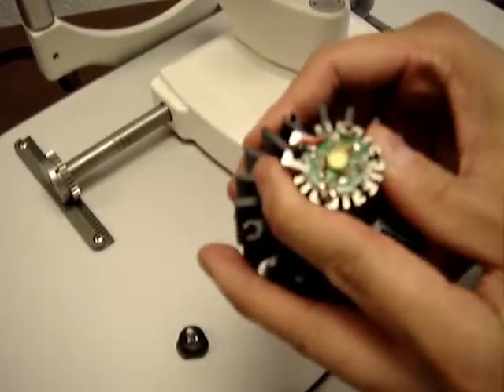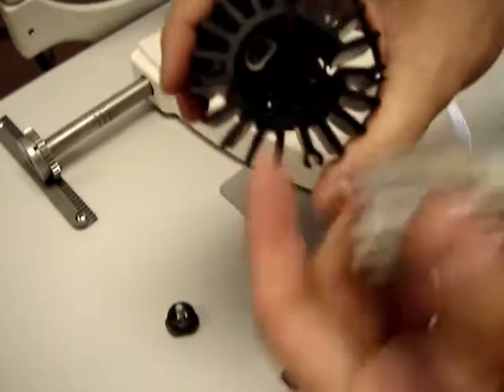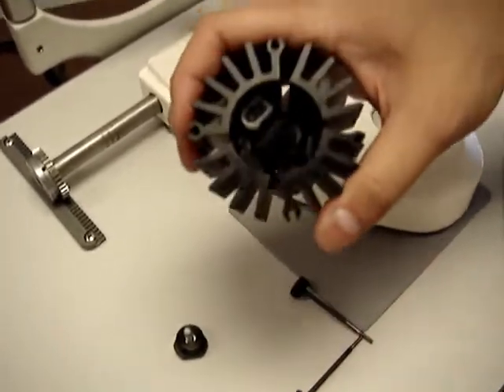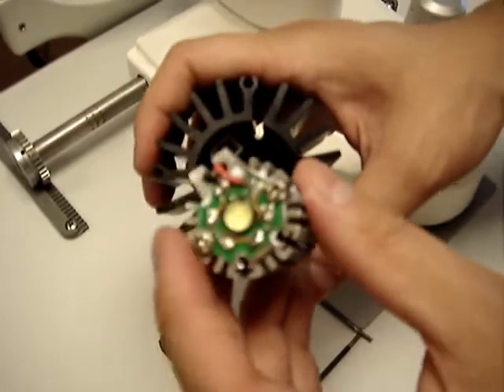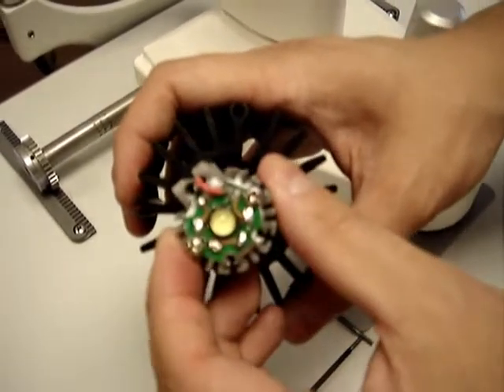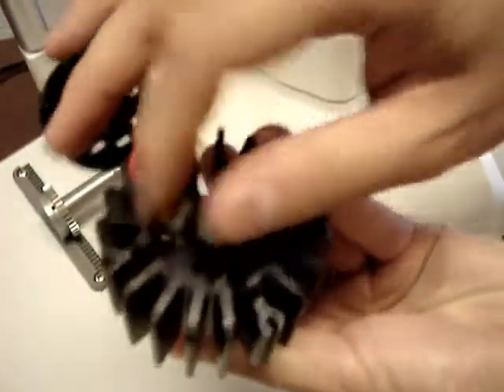Next, you can remove the light bulb from the housing. As you can see, there is the power source to it. When replacing the light bulb, be careful not to touch the green circuit board.